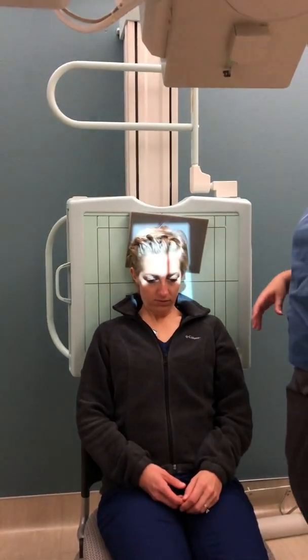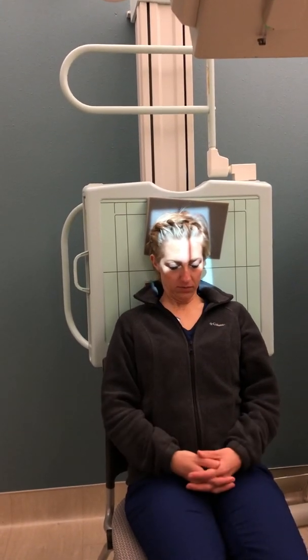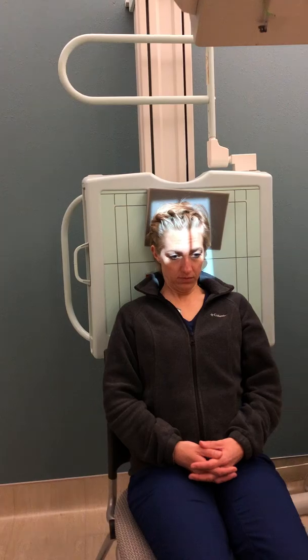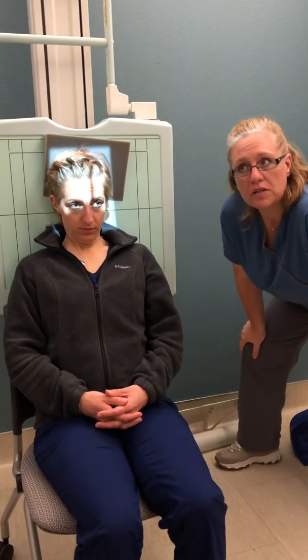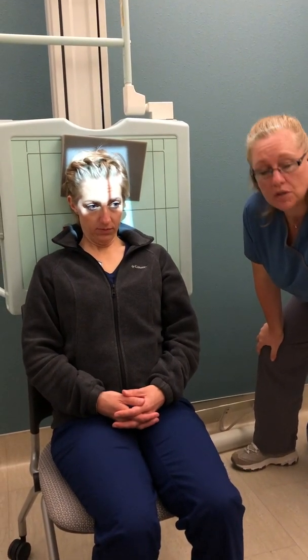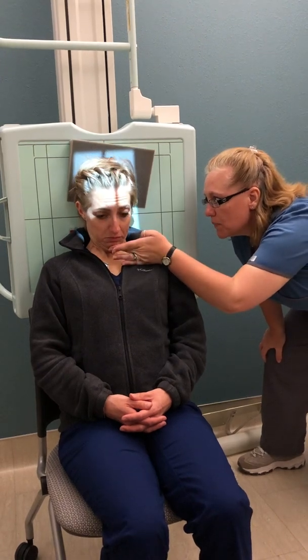This reminds the patient to really keep that neck flexed as much as possible. For anything concerning the head — sinuses, facial bones, all this — you're going to have to make sure that you get down on the patient's level, because it's just like measuring liquids in a measuring cup; you need to see the true line. Bring your chin down just a little bit more — perfect.